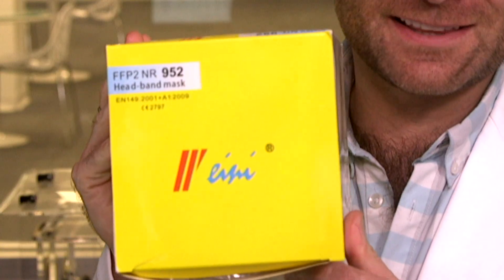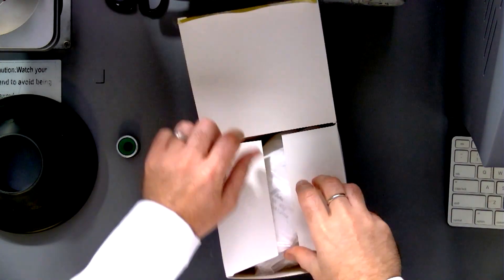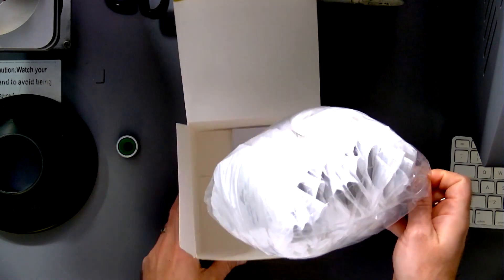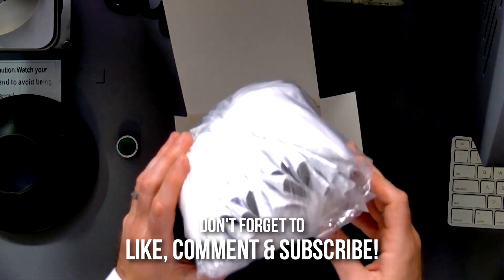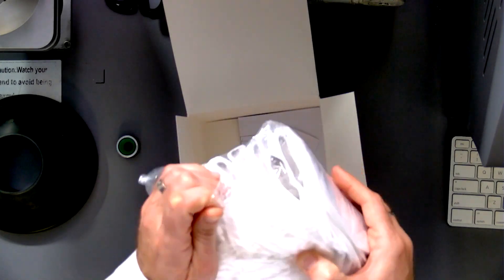Hey everyone, welcome back. We're testing every single mask and respirator on Amazon, including the weenie masks. On Amazon they go as 'Ranto,' so your mileage may vary. Let's open this box and get it in the clamper. That's weird packaging — I don't know why, but it makes me uncomfortable.